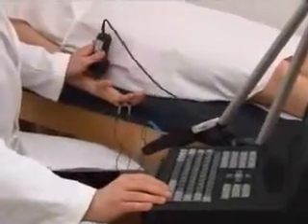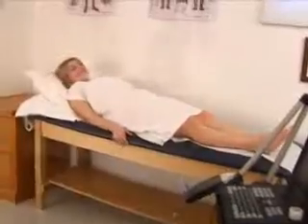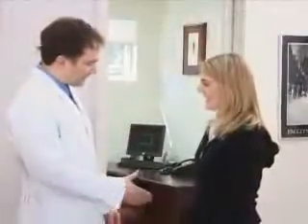The test can last anywhere from 30 to 60 minutes, depending on the number of limbs tested and the complexity of the problem. As there are no lasting side effects from the test, patients may resume all of their usual activities following the test.